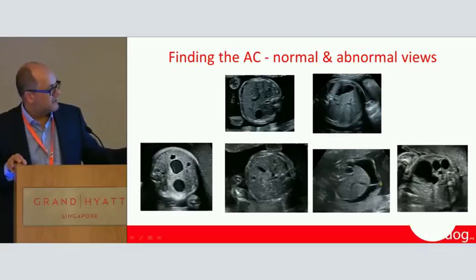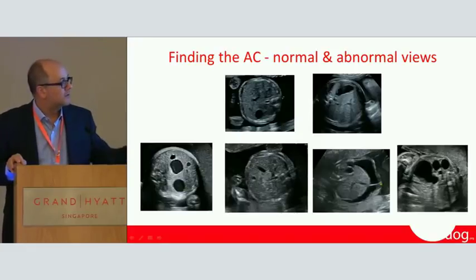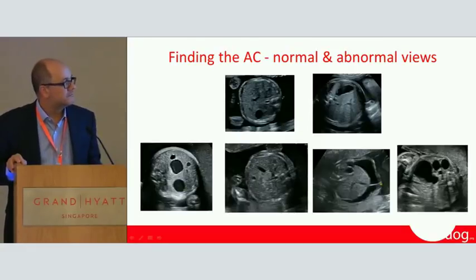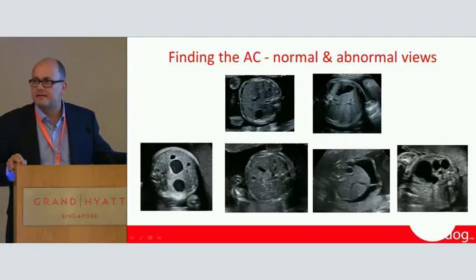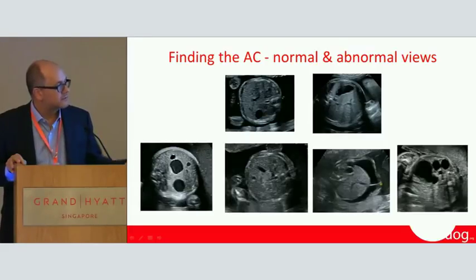Yeah? What about here? What can you see here? What's wrong with that picture? Compare it to the one directly above. Yeah, there's no stomach. What's that there? That's the umbilical vein. What's that structure there? It's a gallbladder. Yeah? This is the left side of the baby. This is the right side of the baby. It's unfair because I'm not telling you which is the right and this is the left. But here is where you should have the stomach, so this baby has no stomach visible.